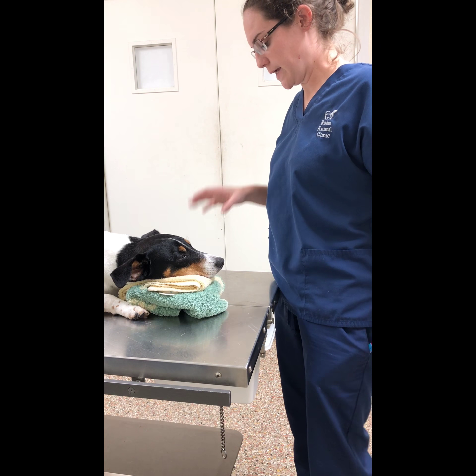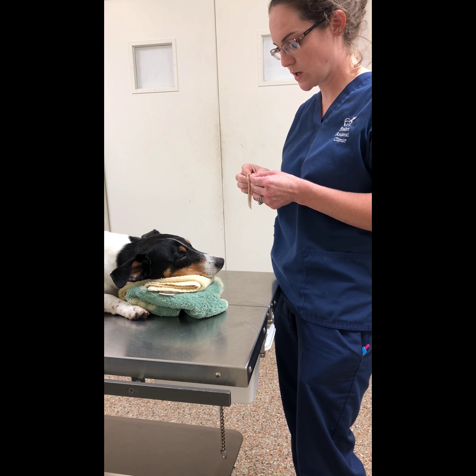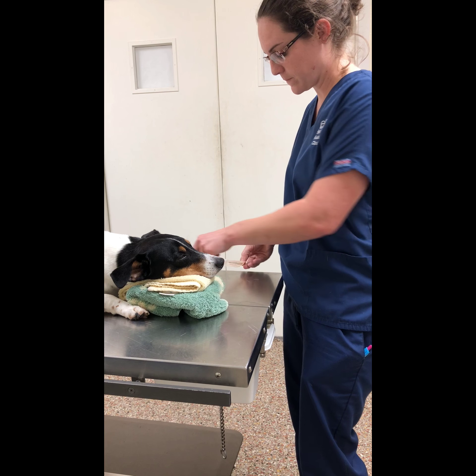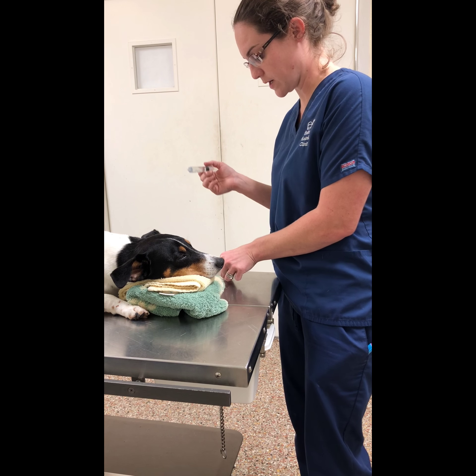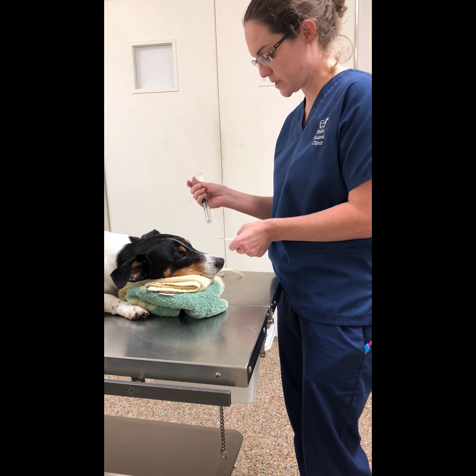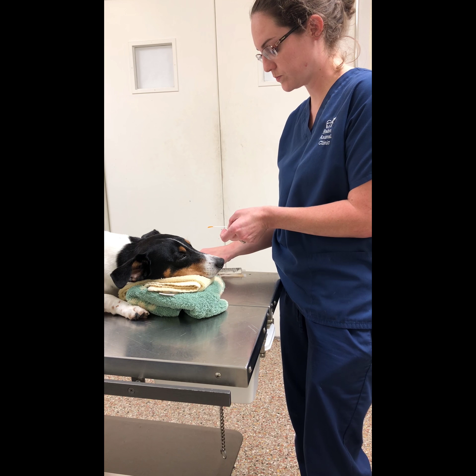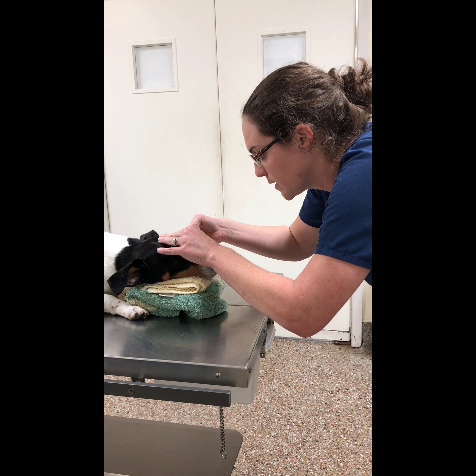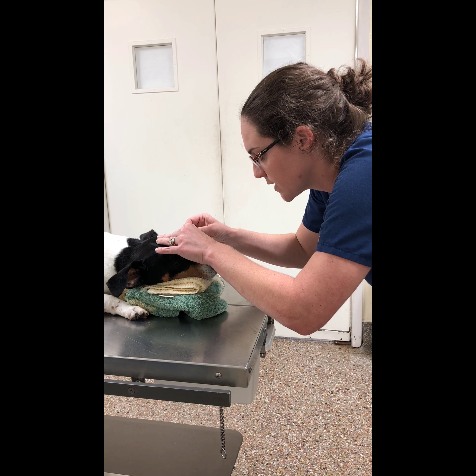I'm going to be doing a fluorescein stain test on him. I've got my stain strips right here and I've got some flush. I'm going to go ahead and wet the stain strips and then I'm just going to put the dye — the stain — into the eye.